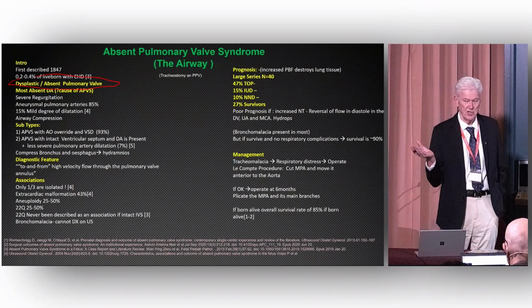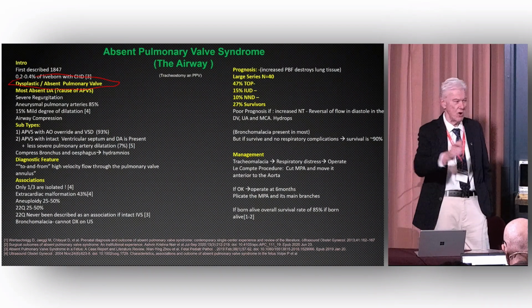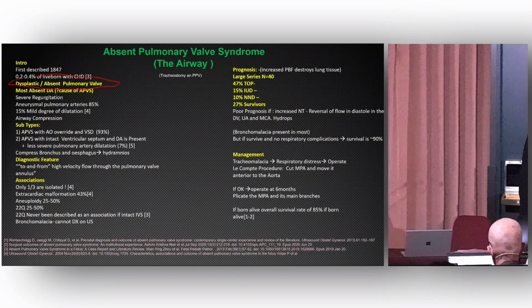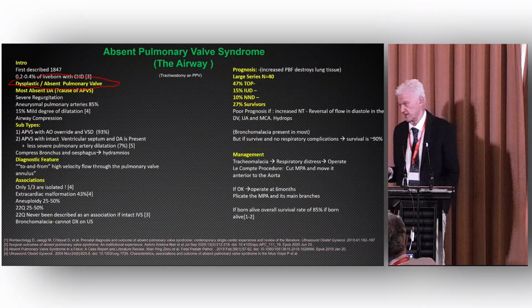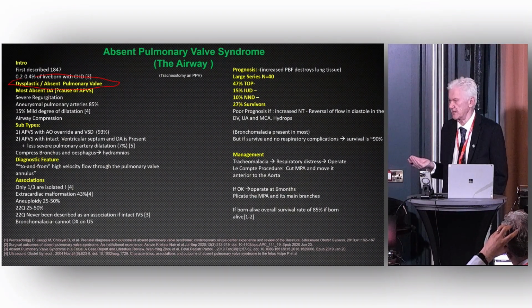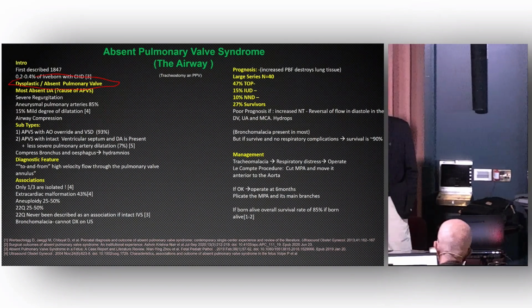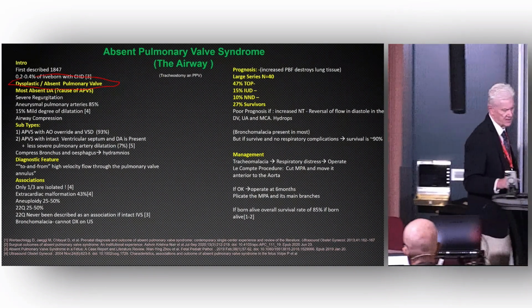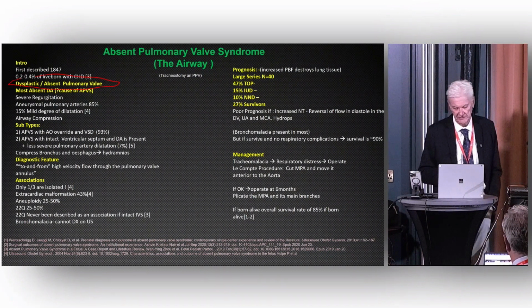I've just described. You look from a four-chamber view up to a right ventricular outflow tract, and you see the seesaw motion, equal volume of forward and reversal of flow across the pulmonary artery. In the first trimester, we see them, and there's no dilatation in the pulmonary artery. In the second trimester of pregnancy, you see this gross dilatation. And when you first look at a four-chamber view of heart, it strikes you, you say, crikey, is there a left atrial aneurysm? And then when you put it on colored Doppler examination, you see that seesaw motion of high volume of flow.